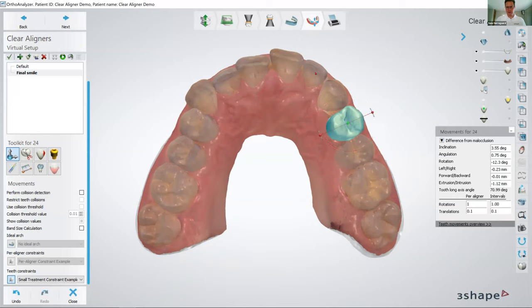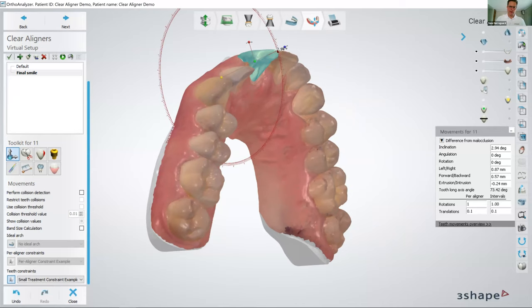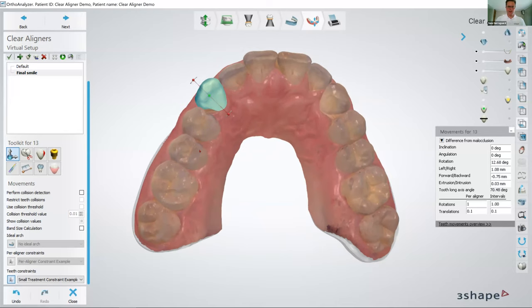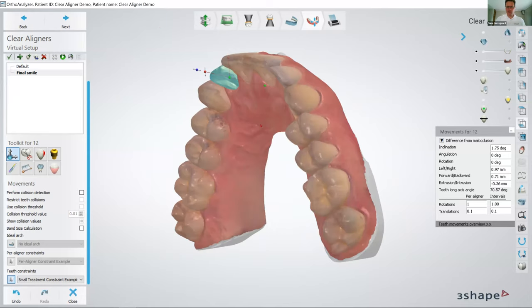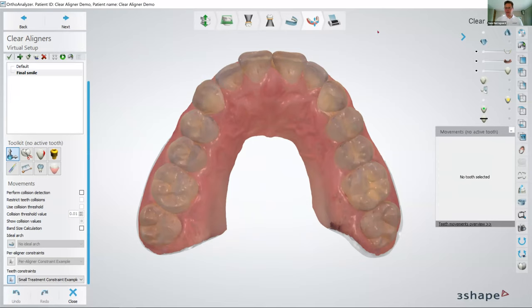So if I create a little bit more space here, more tooth movements like that, then we can create a scenario that looks a little bit more like straight teeth. Now we should have some space for this canine to get in here. Yeah, I know maybe we are exaggerating too much, and this would not be possible to facilitate in a real treatment. It's just so that you get an idea about how you move the teeth around.